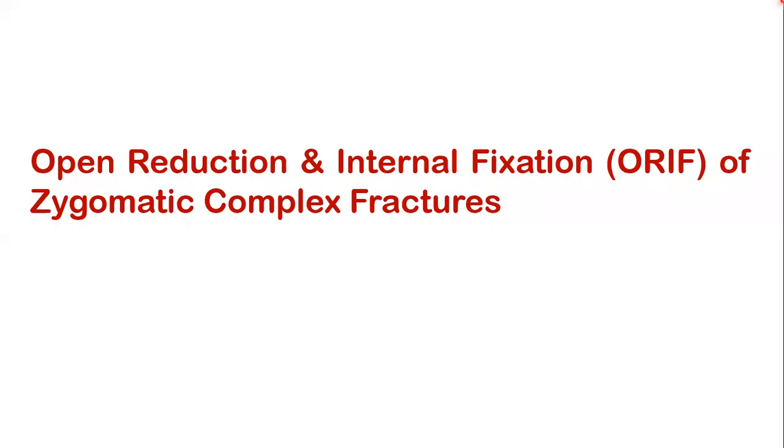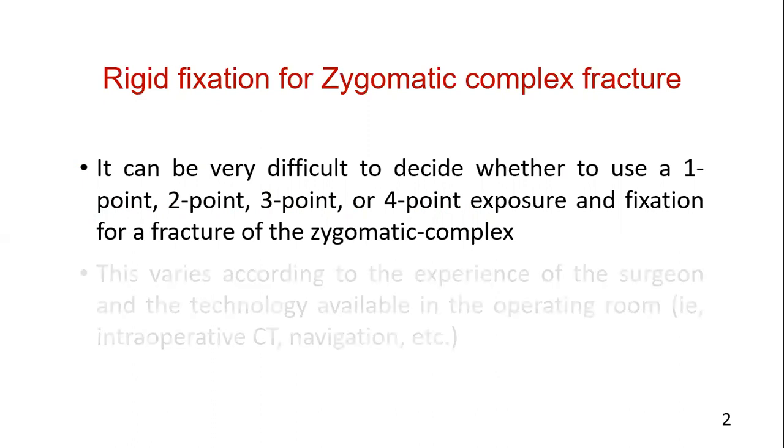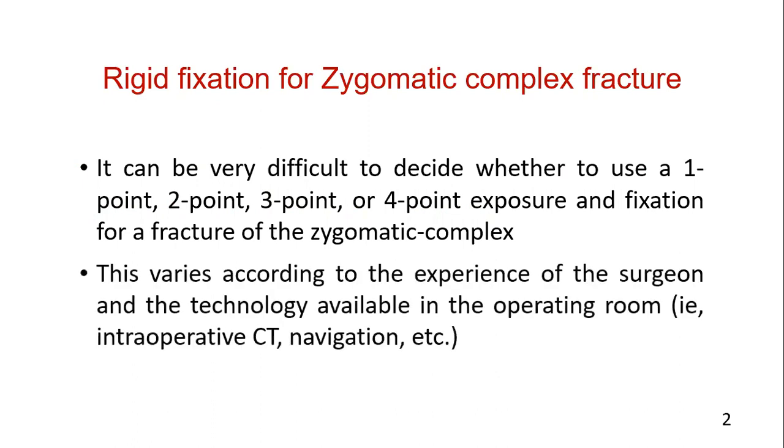In this video, we will explain the open reduction and internal fixation of zygomatic complex fracture. It is very difficult to decide to use a 1 point, 2 point, 3 point, or 4 point exposure and fixation of the zygomatic complex fracture. It will depend upon the experience of the surgeon and the technology available for the surgical procedure.